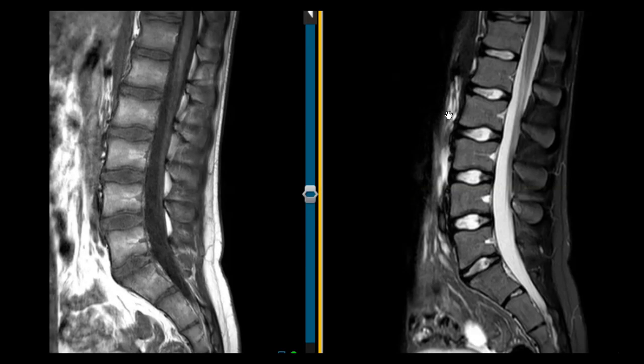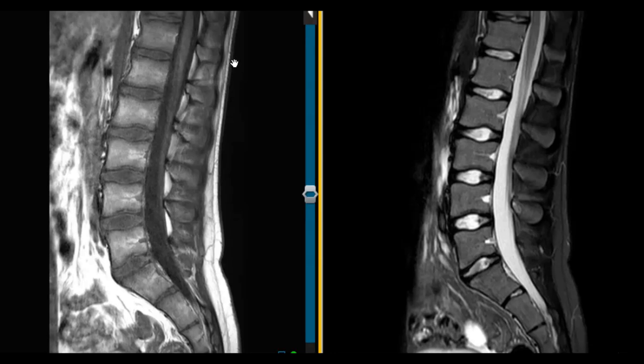Hello, this is Dr. Gay from Forsythic MRI, and this is a quick example of PARS defects or PARS stress fractures in a young girl. She's a 15-year-old and she fell a couple of weeks ago and is now complaining of low back pain, and x-rays are normal.